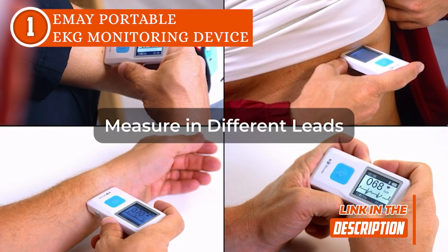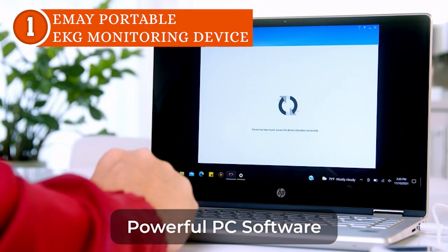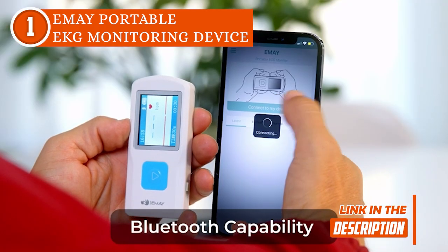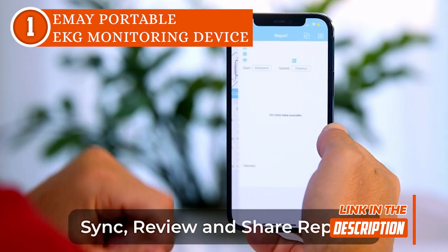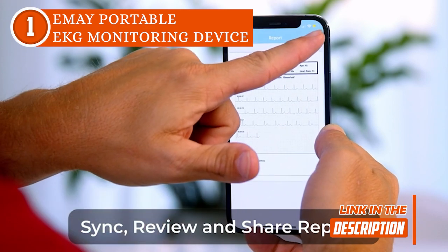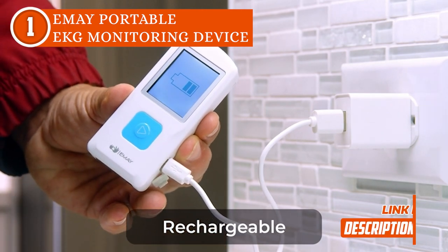Along with being convenient, the portable type has the benefit of delivering results right away. It can also be used in a matter of seconds, unlike the standard ones which at the very least require a few minutes. It has a large LCD screen where you can view the real-time EKG waveform and heart rate during the entire recording process. It also displays information as soon as the recording ends, which saves you precious time.